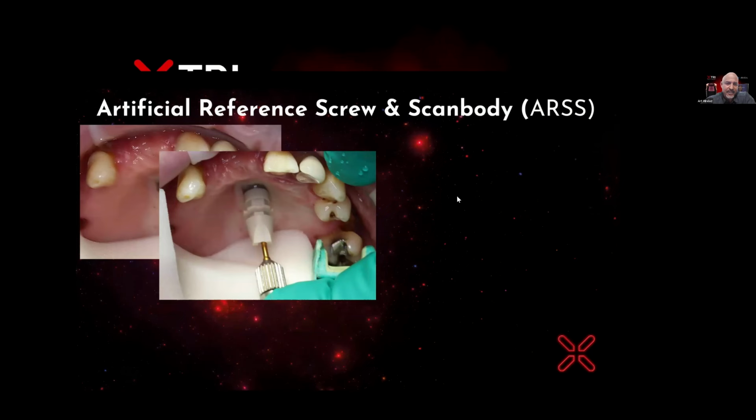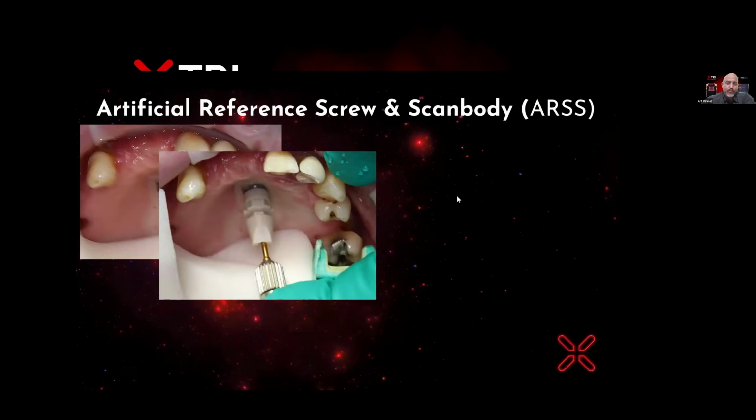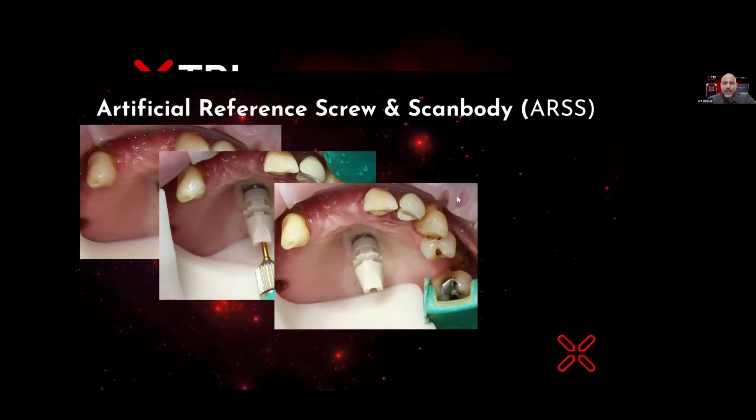You attach it to the artificial reference screw. You'll notice that it's indexed. It's a 4 millimeter square. The reason it's indexed is because when you take your second scan with the implants, you need to make sure this fiducial goes in the same exact position. If you place this fiducial in at at least 35 Newton centimeters, there's no need to put extra holes in the patient's palate. One is enough. The key is making sure the torque is significant enough so that during surgery, as you're reflecting, it's not going to move. This is what it looks like once it's screwed in.